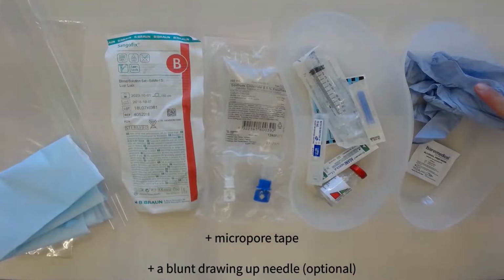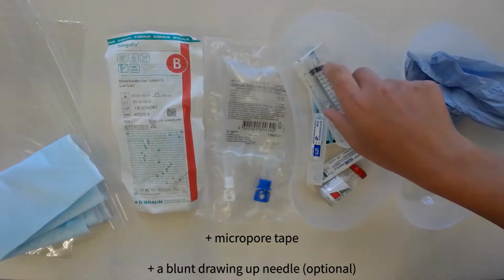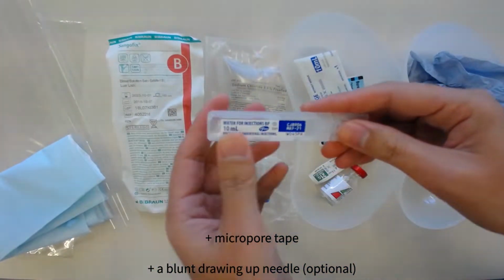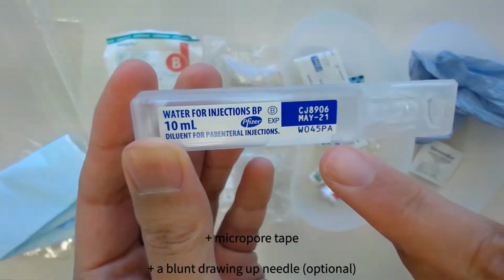Collect your equipment. Here you can see in this kidney dish, I've got a pair of non-sterile gloves, at least 2 alcohol wipes. Here is a 10 ml syringe. This is my diluent, which is the water for injections, 10 milliliters. You can also see the expiry date there.